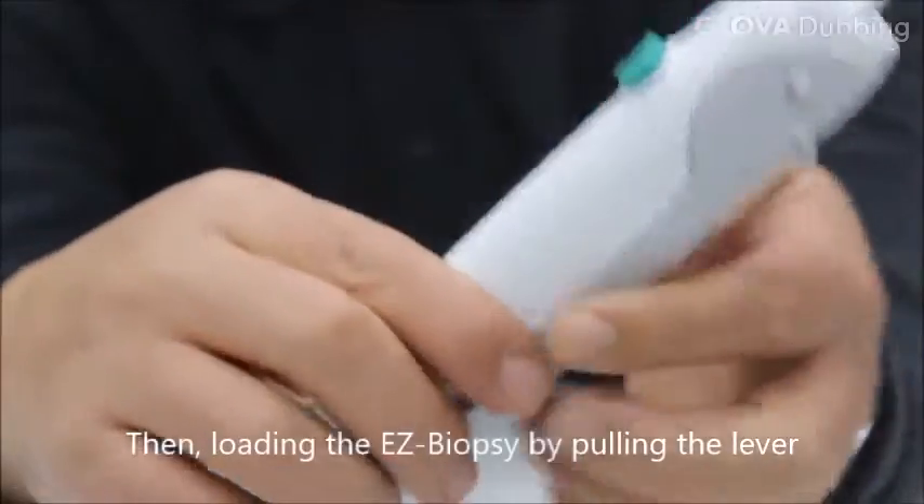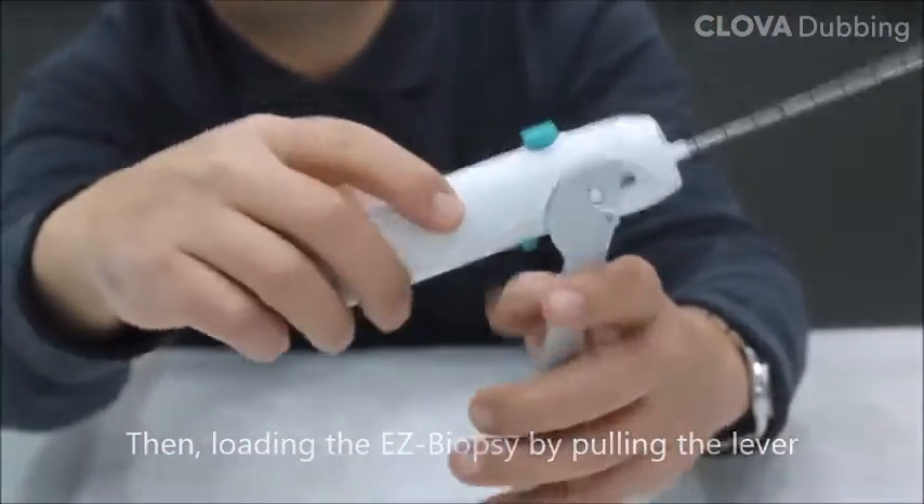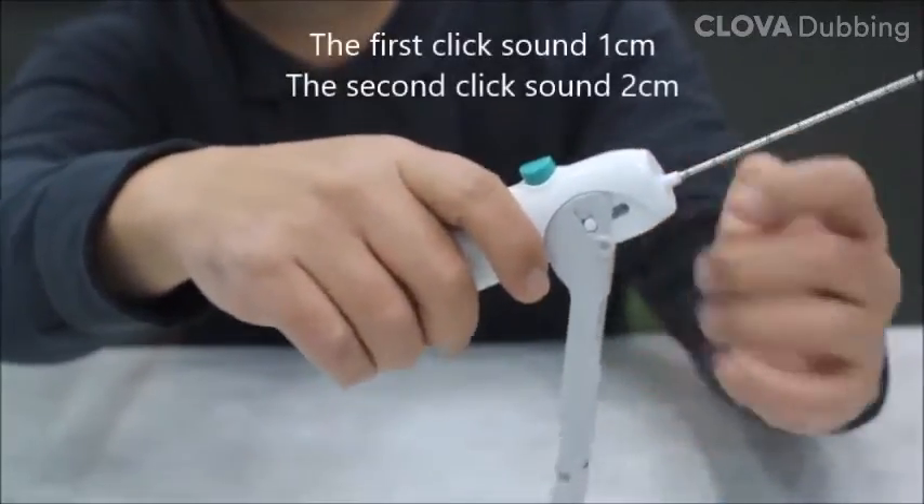Then, load the device by pulling the lever. The first click sound is the 1 cm setting and the second click sound is the 2 cm setting.